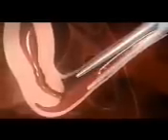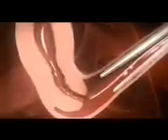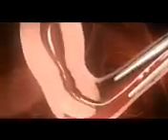After two or three days, a healthy embryo will comprise around eight cells. It is then transferred to the uterus by means of a thin flexible tube, where it is left to implant and form a pregnancy.